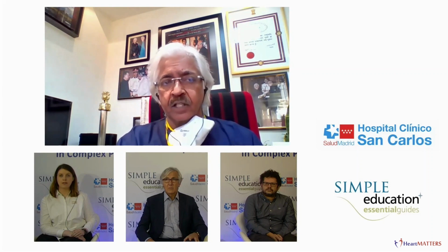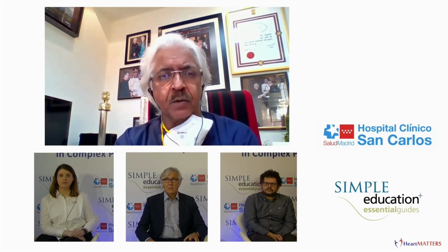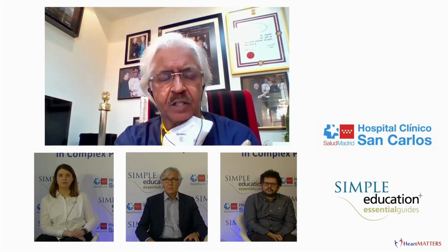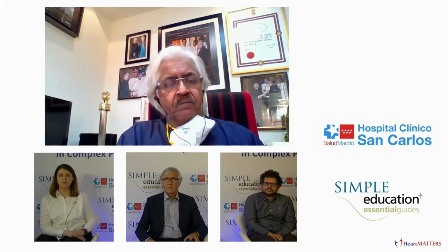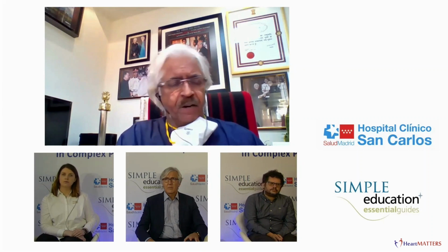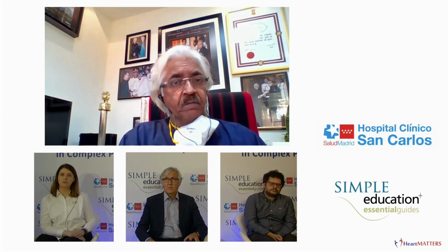Would you just rely on iFR alone? Is there a discordance between FFR and iFR in the intermediate scenarios? And what do we follow? That's a question which arises regularly. We can put our hat on a 0.73, but we somehow wonder what to do with an iFR of 0.85, or 0.82. So that's one of the aspects.